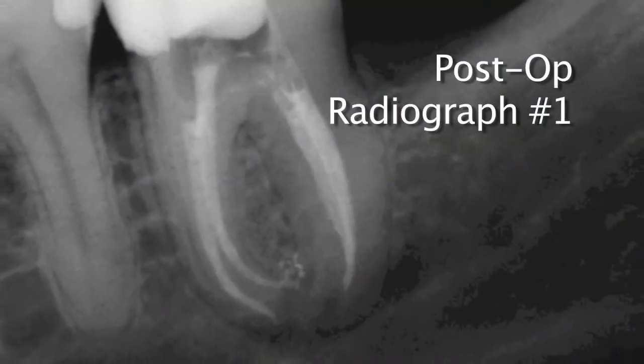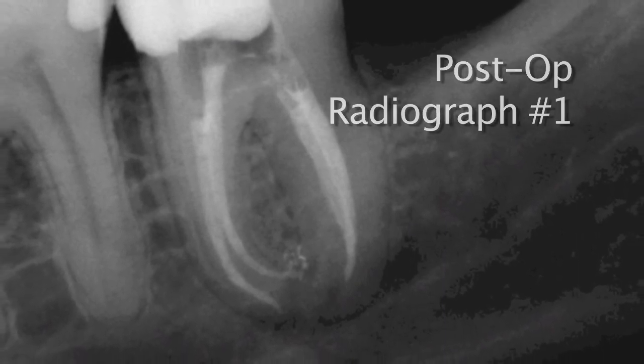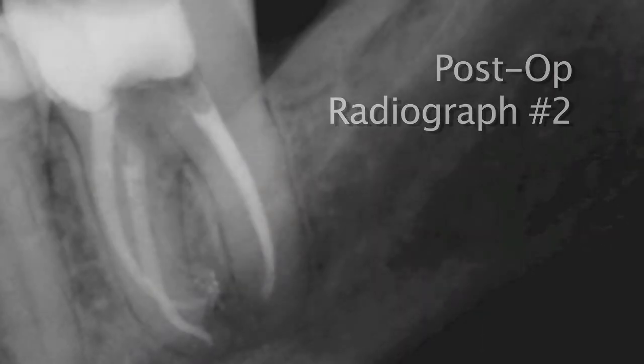You will now see two final radiographs from this case — a straight-on and a shift film — demonstrating the nice conservative shape the Wave 1 reciprocating instrument achieves. As you can see, this was a challenging case, but it is my basic sequence for most root canal treatments that I do. The Wave 1 reciprocating instrument allowed me to achieve a shape that is both conservative and predictable for years to come.